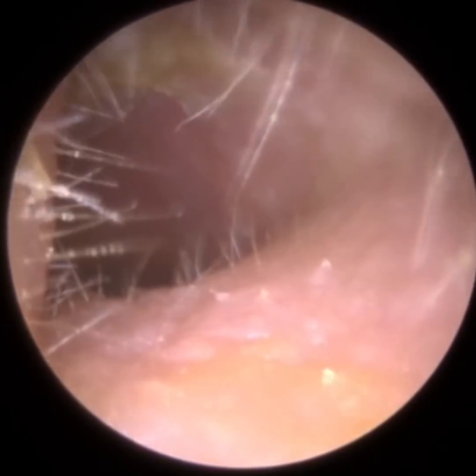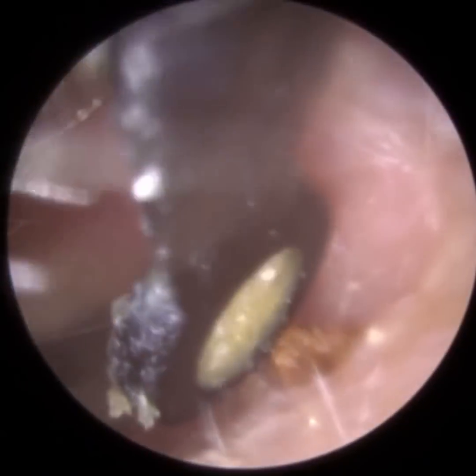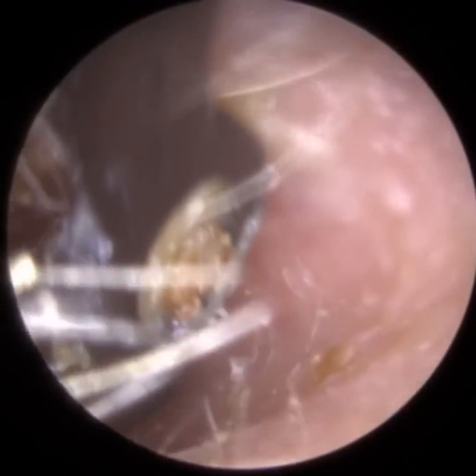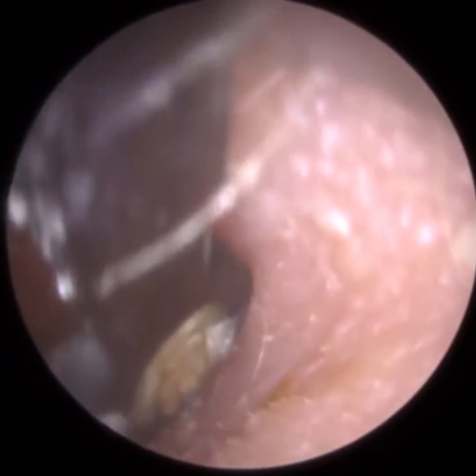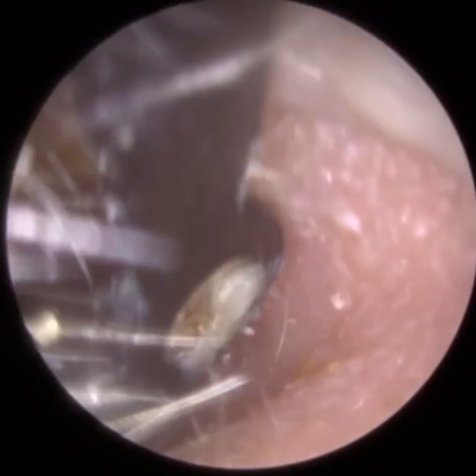And there's just a bit of debris there, just at the base of the ear canal again, because we're on the cartilaginous portion. We're near the juncture there, the bony part and the cartilaginous part, what we call the osteocartilaginous juncture. So it's just going to be a bit gentle there. And so there's a bit of debris on the right side of the ear canal, which I will get in a moment.